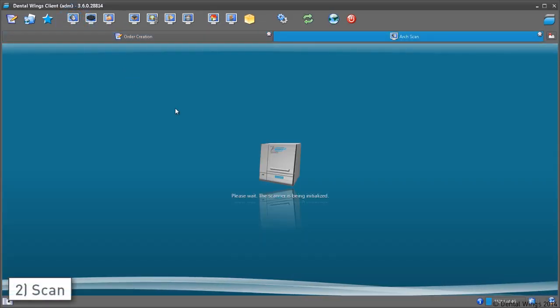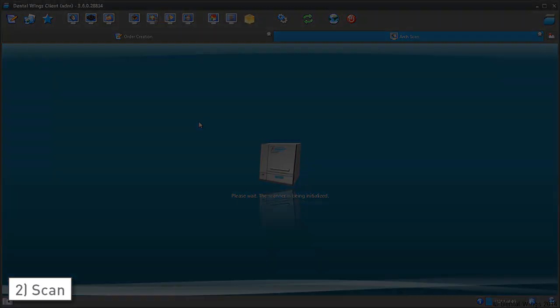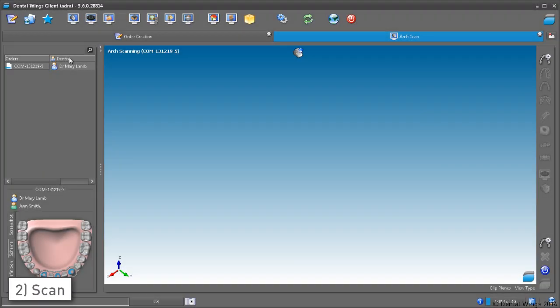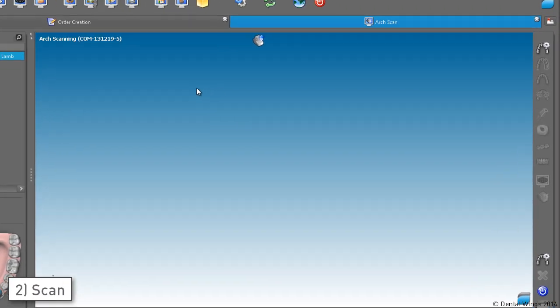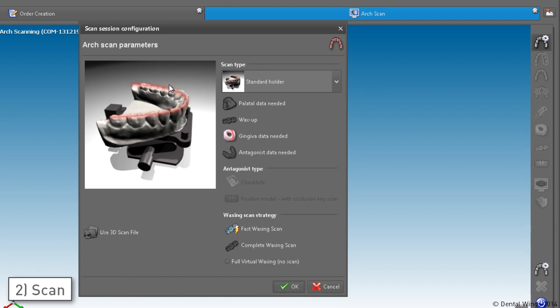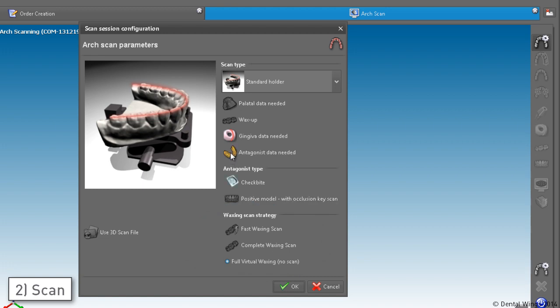Next, open the arch scan station and drag the order into the main view to initiate the scan session. The most important option here is the one that tells DWAS that you don't have a handmade wax-up to scan, but you want the software to create a virtual one.